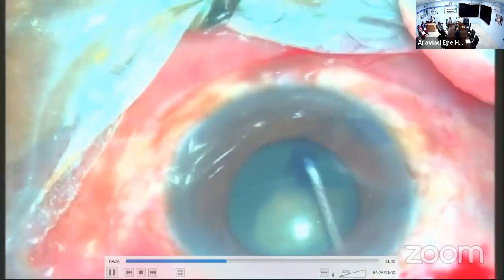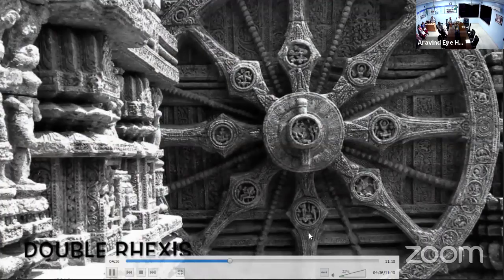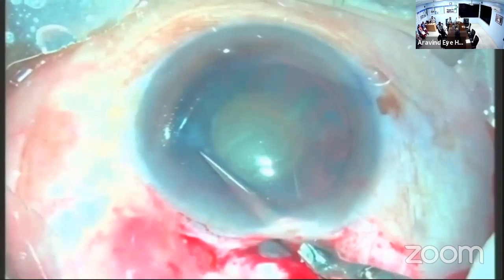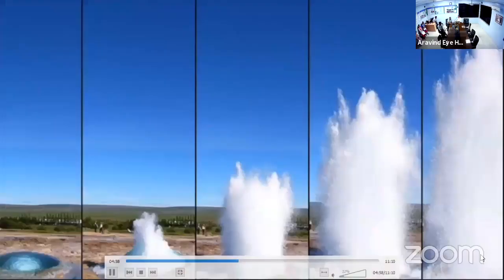The one other common problem is we end up having a small rhexis, like in this video, whereas the nucleus is going to be very large. The main tip here is to do radial cuts on all four quadrants so that it becomes like a can opener and you can proceed with your surgery as such. One other thing that you can do when you have a small rhexis is give an oblique cut on the rhexis margin and use a rhexis holding forceps to complete a double rhexis toward the desired size.